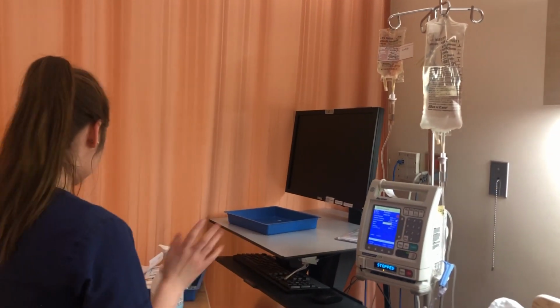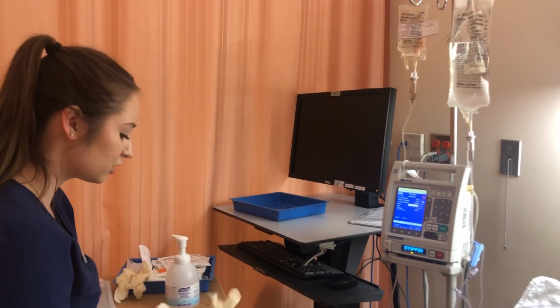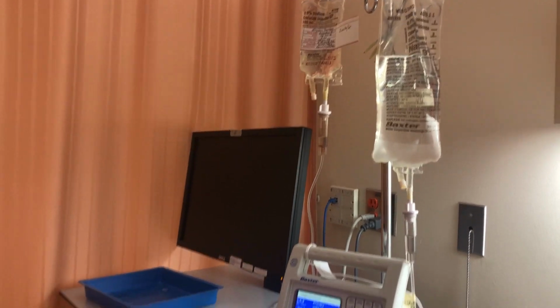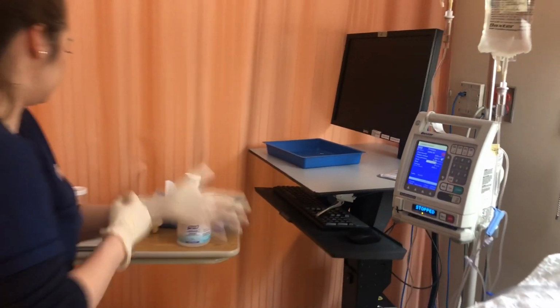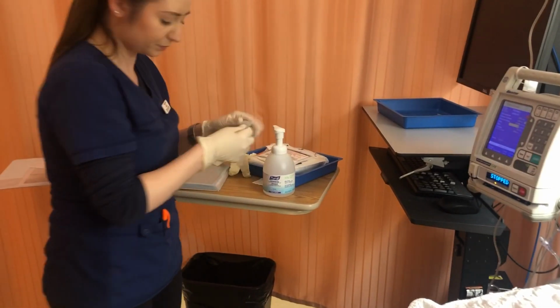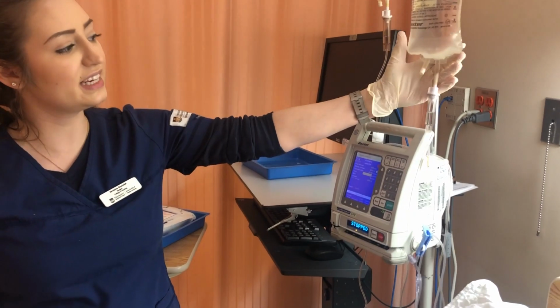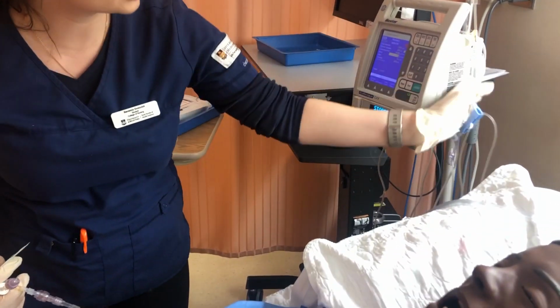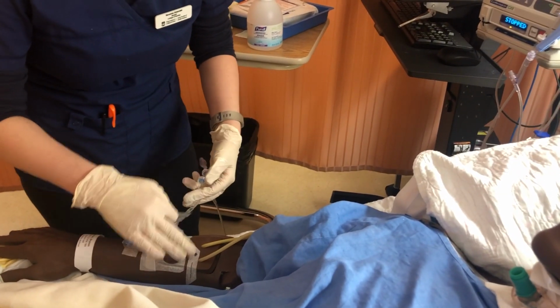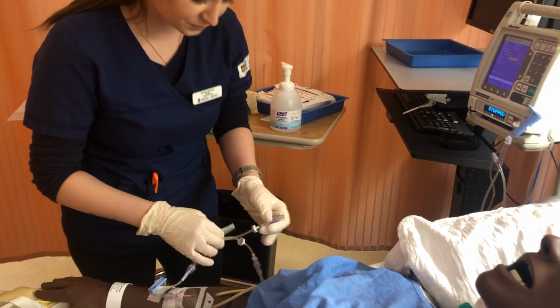Okay, so now that the second check is done, I'm going to attach it to my patient. So I'm just going to use gloves. And I've got my alcohol swab here. So I know that my normal saline is running at TKO. I can see that it's dripping. I'm just going to follow the line along till it reaches my patient. I'm going to assess the site and make sure that there's no redness, swelling, and there's no pain.